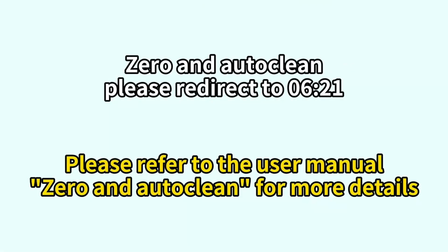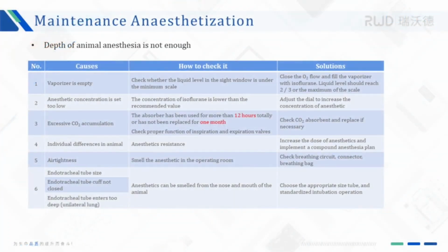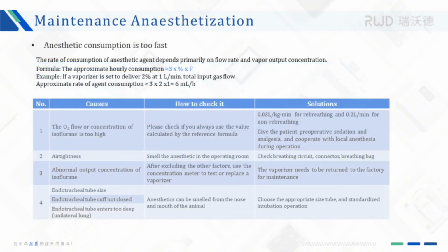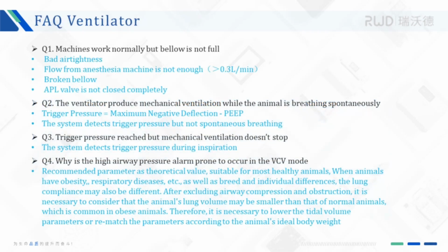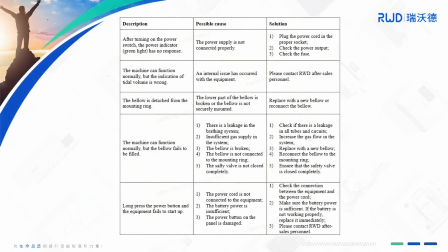For zero and auto clean, please redirect to 6 minutes and 21 seconds. Please check the video to browse some frequently asked questions and solutions. Please check the video to browse the troubleshooting.